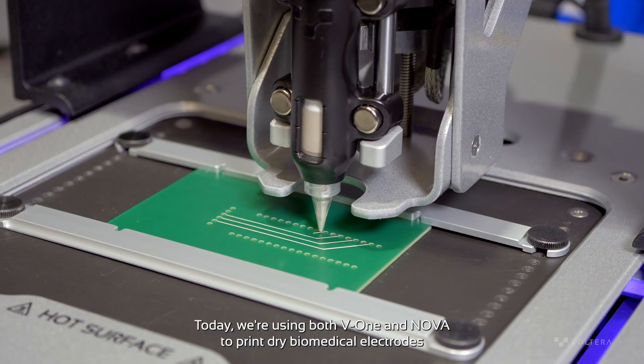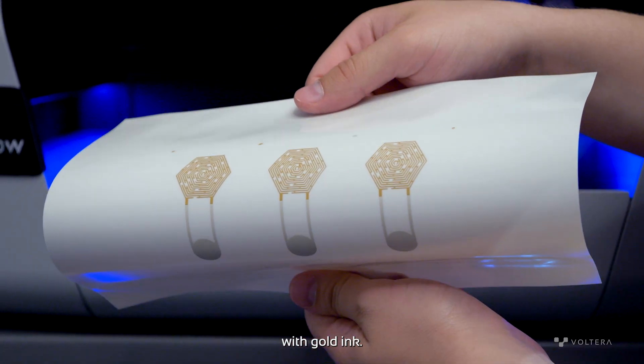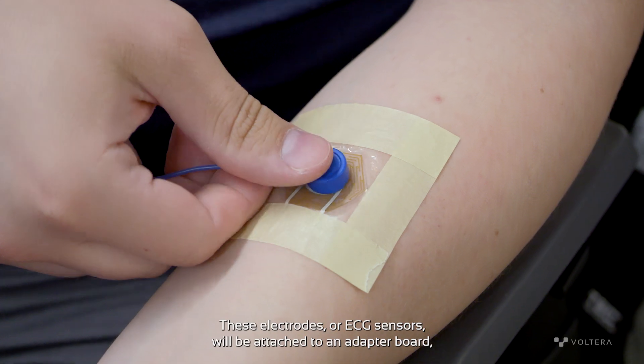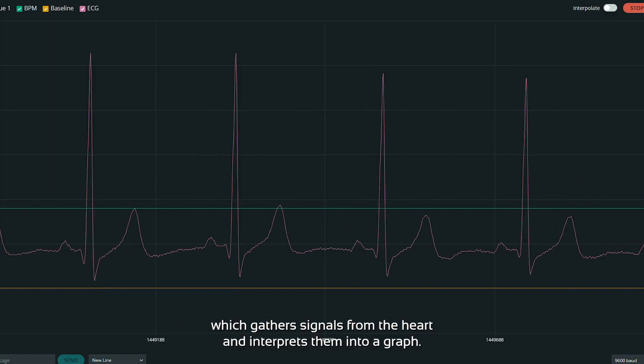Hi, I'm Frank Bank, factory engineer at Voltera. Today, we're using both V-One and NOVA to print dry biomedical electrodes with gold ink. These electrodes, or ECG sensors, will be attached to an adapter board which gathers signals from the heart and interprets them into a graph.